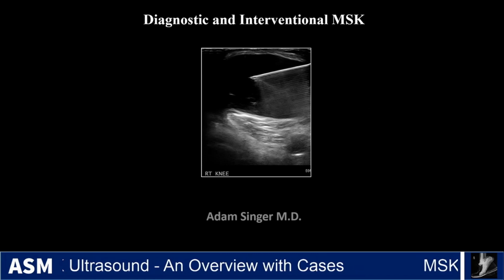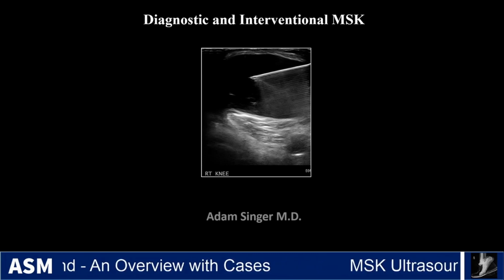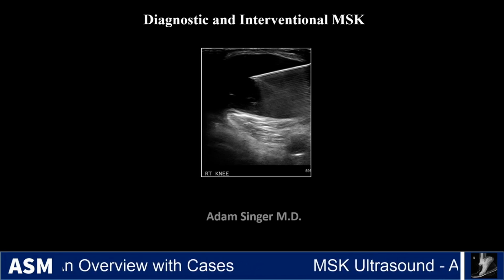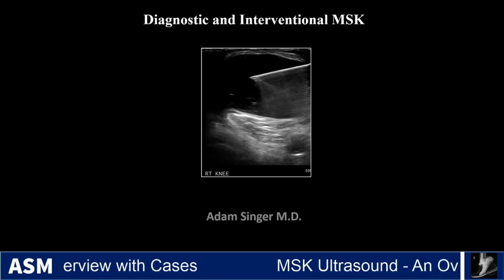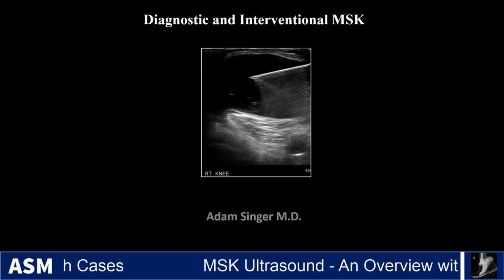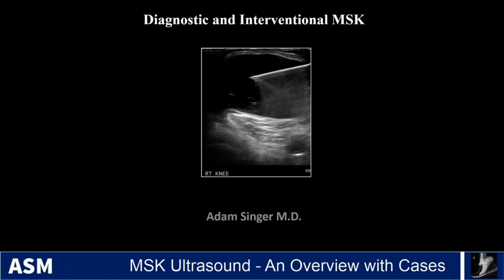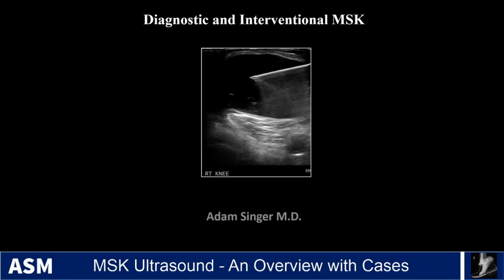And today I'm going to be discussing Diagnostic and Interventional MSK Ultrasound. This topic is being discussed in general, but also can be used for board review for the radiology core exam and certifying exam, touching on basic topics that you may encounter on such examinations.